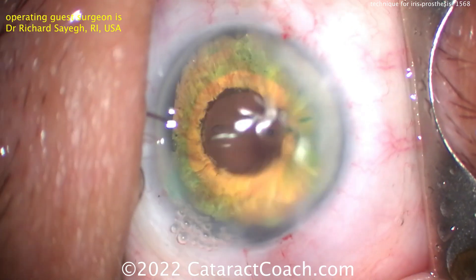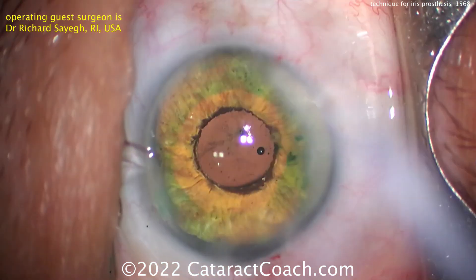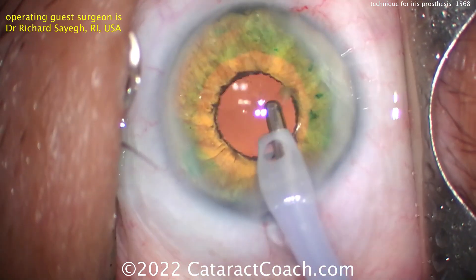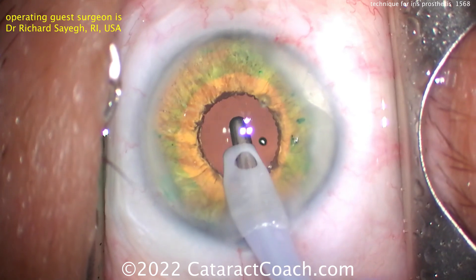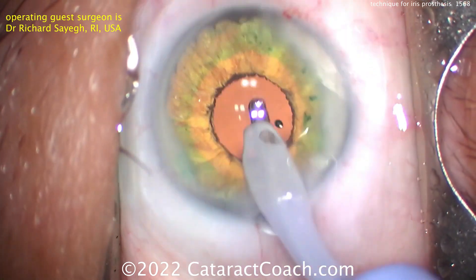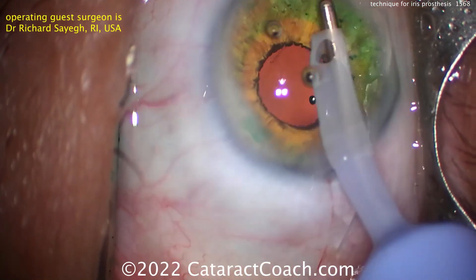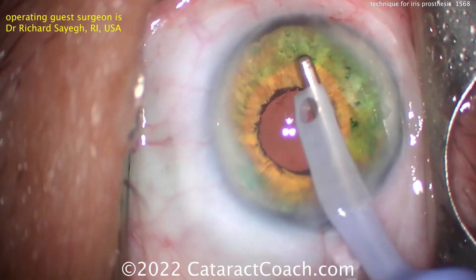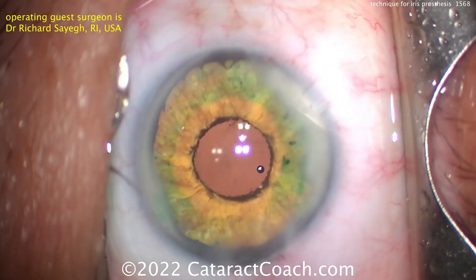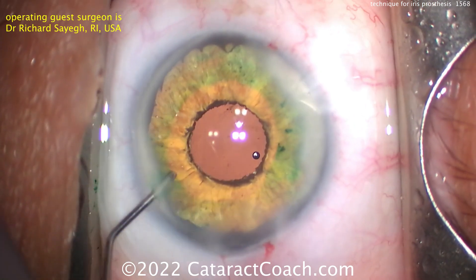That looks just fantastic. Now this pupil is fixed — it doesn't dilate. But it's a sufficient size to cut down on glare and give the patient better visual quality. It also looks very good from a cosmetic perspective at conversation distance, about a meter away. And it's a big enough opening to allow full examination of the posterior segment and retina periphery with wide-angle imaging. Everything looks good — removing the viscoelastic. This patient's going to be very happy, and that green dye will slowly wash off over the next couple of days. That just looks beautiful.